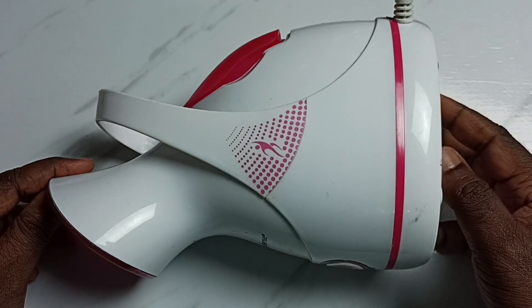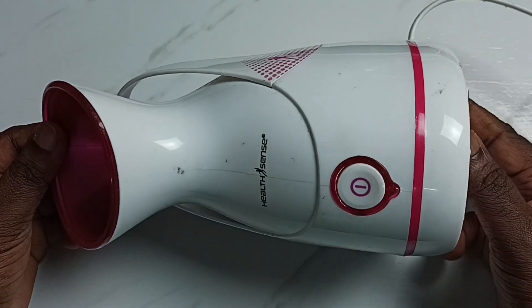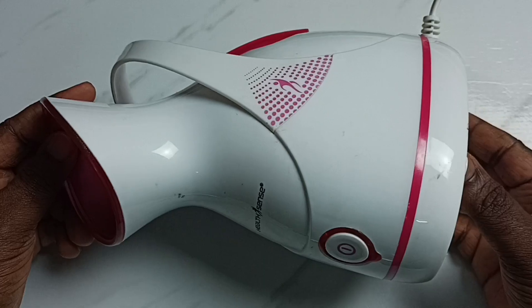Hi friends, in this video I am going to check what is inside of this Healthsense steamer.